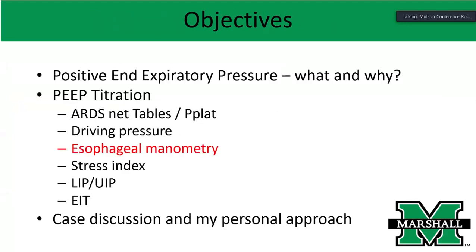I have another question if you don't mind. So let's say that we are trying to recruit more lung depending on our driving pressure. How much time would you actually give it between when you adjust your PEEP until you titrate your driving pressure? That's a good question. So they should go hand in hand. But I think Rami is saying if you increase PEEP, if you give it time, the lung will recruit. So I don't know, to be honest, the exact answer.